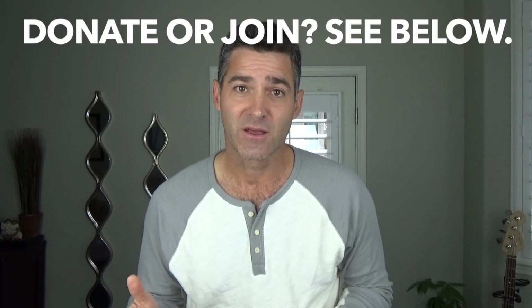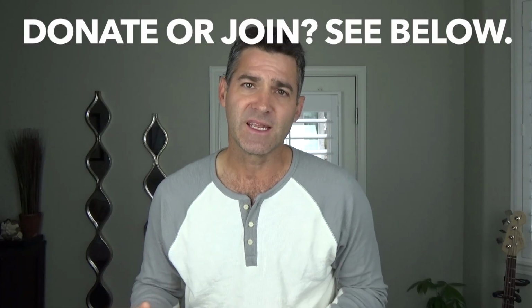Okay, one last important thing is changing your pressure. I would not take it lightly. Typically people have a prescribed pressure for a reason, although we all know that physicians make huge mistakes with this all the time. So if you're making any changes, please do so with some data points. That's why I highly recommend using Oscar. You can look at the data, you can see if you're having legitimate events or not. You really don't just want to be changing the pressure just to change it. I also always encourage people to try to communicate their changes or what their thoughts are, their therapy problems, with their physician first. If your physician is a butthole, then yeah, go ahead and do it yourself. But otherwise, I usually recommend working with your physician as much as possible to keep them in the loop since they know your entire medical history. All right, with that, let's get on with the video.